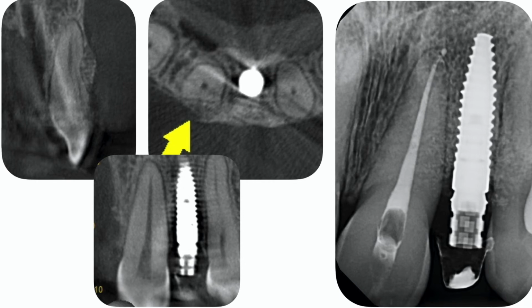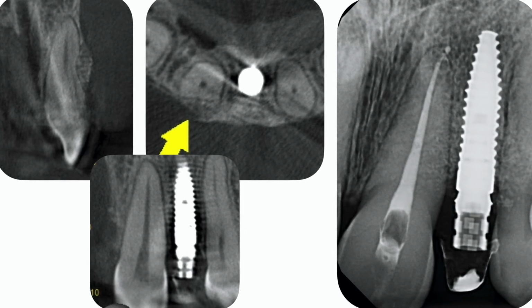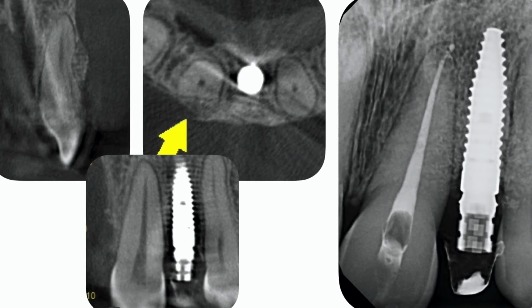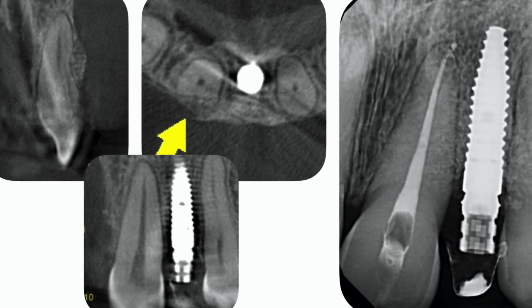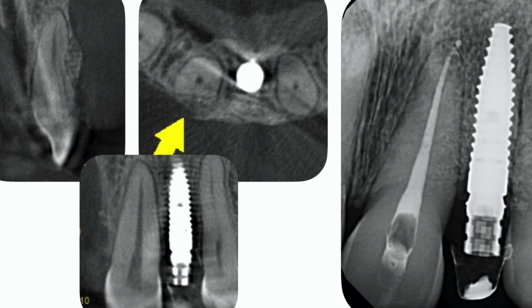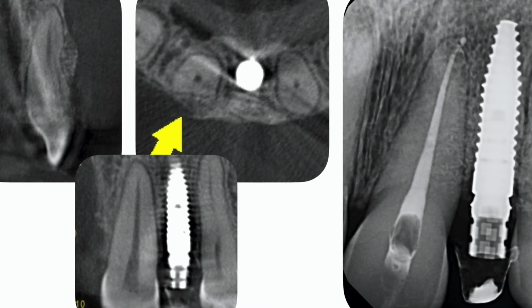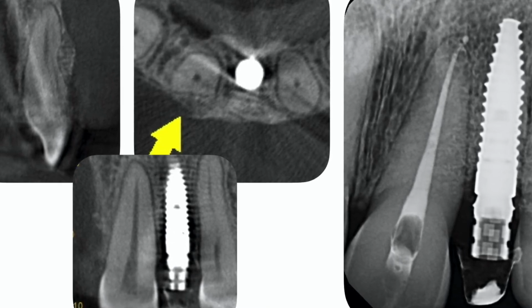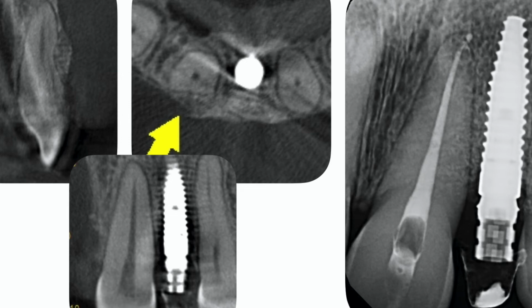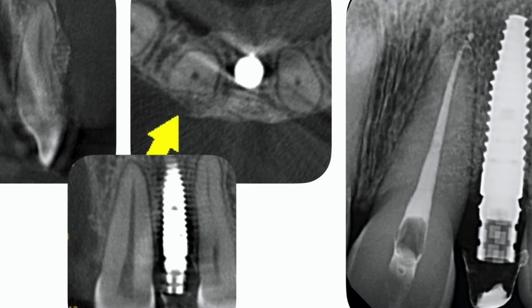And the other thing that I wanted to mention is these days, just like everything else, we are very mindful of preserving as much tooth structure as we can when we're doing root canal therapy. So when you look at this post-operative radiograph, it's extended to the radiographic terminus, it's appropriate in 3D, but we haven't sacrificed a lot of tooth structure. This is an important tooth. The last thing Hamid wants, and the last thing Keith wants, is to have to deal with another implant in this position. So we want to leave the tooth intact with as low a chance of fracture in the future as possible. That's really the main points that I wanted to get across on the endodontic portion.